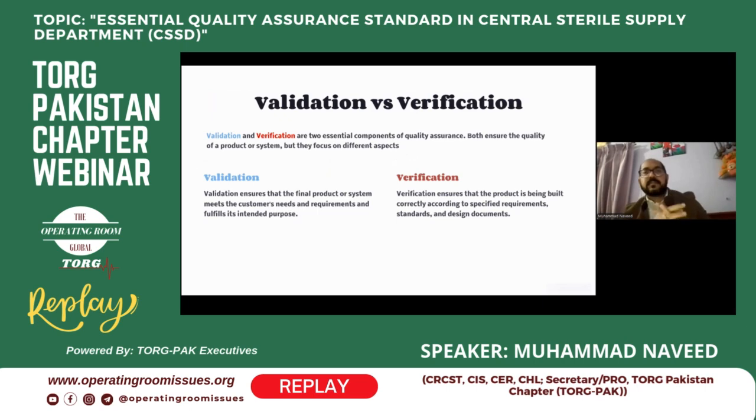In CSSD, our final customer is the OR. So when our process is finished, our department's vision and goal is to achieve sterility, so that our instruments and medical devices are safe for patient safety. So it is mandatory that our process is validated and verified.